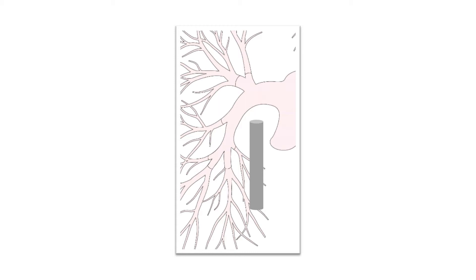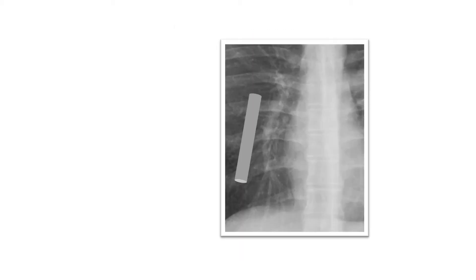Blood vessels have the shape of cylinders and course in various directions. If the course of the blood vessel is vertical, then we can predict that the radiological shape will be a rectangle. On this X-ray examination, adjacent to the right heart border, we see vertical white rectangles which represent branches of the right pulmonary artery.